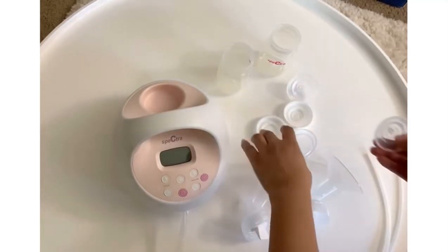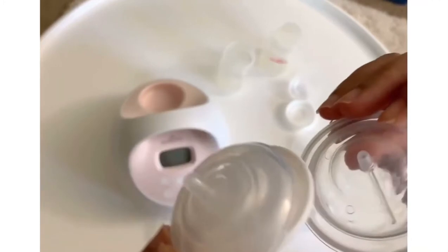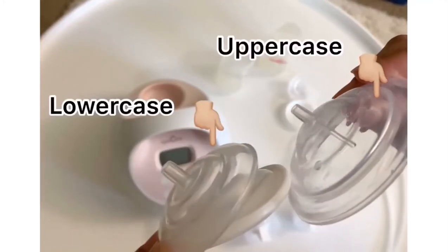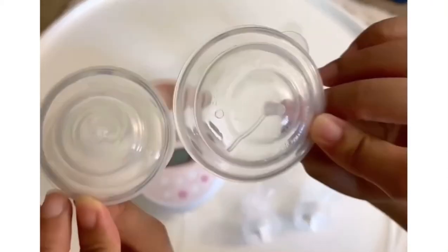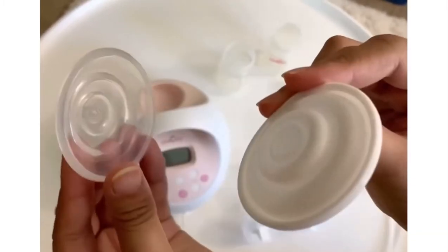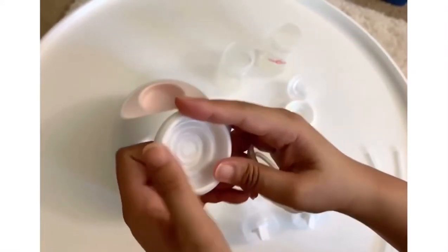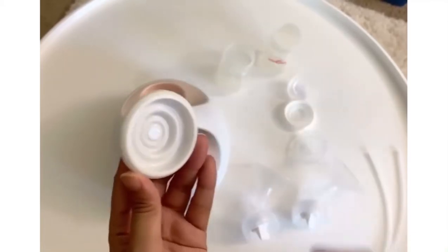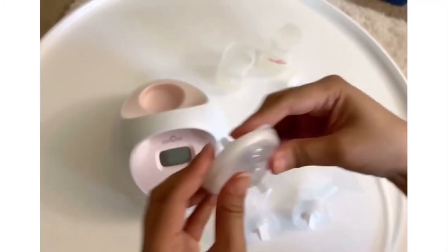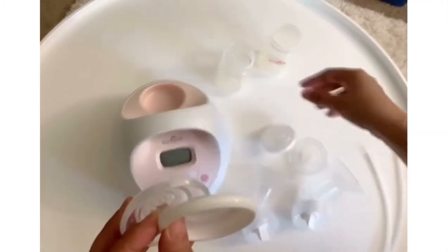Next, I'm going to assemble the backflow protectors. It has three parts: the upper and lower case of the backflow protector, and it also includes a silicone membrane. We are going to attach the silicone membrane to the smaller case. Securely push it towards the case, then connect the bigger one. Do the same for the other backflow protector.